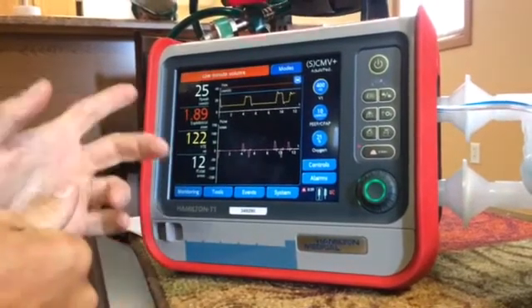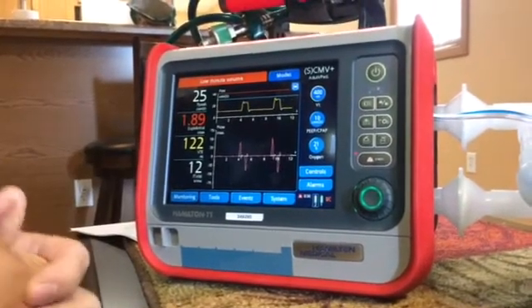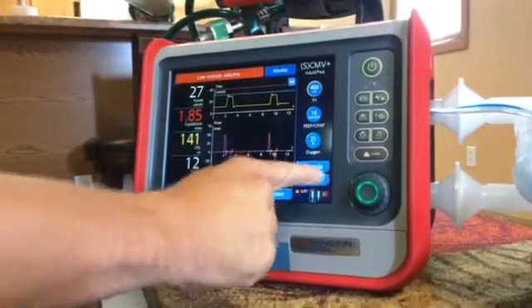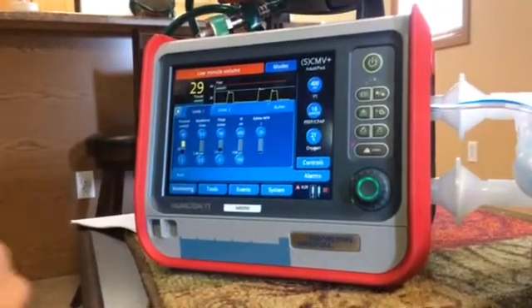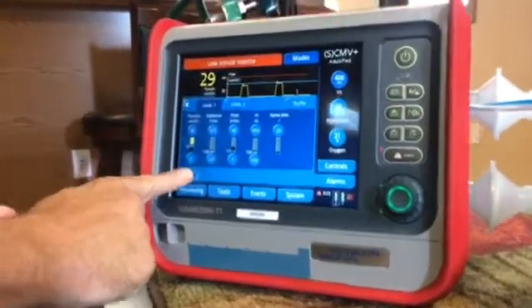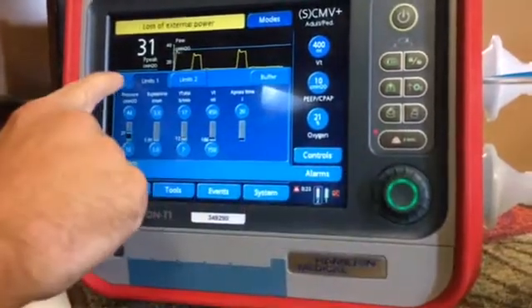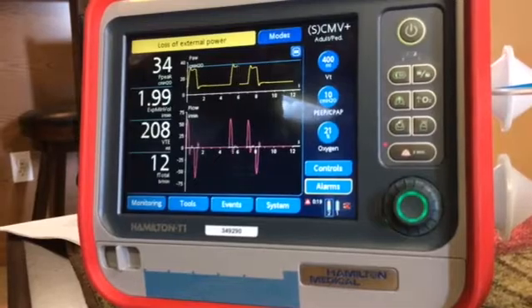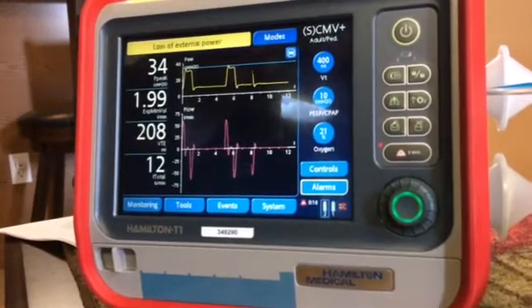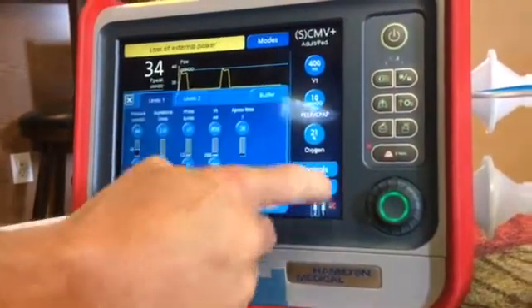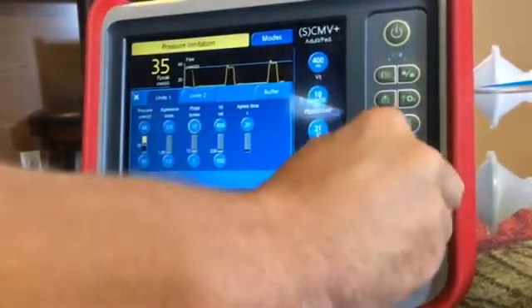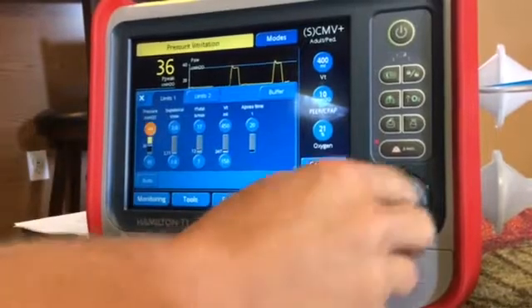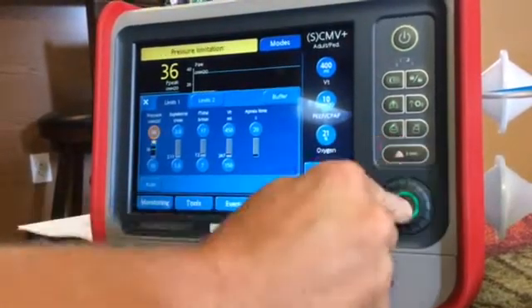Right now you notice we're getting a low minute volume alarm. What's cool about this ventilator is you can go into Alarms and hit Auto. When you hit that Auto function, it automatically sets your alarms for that patient — notice the low minute ventilation alarm went away. You can also manually set these alarms; if you wanted to set your high pressure limit to 60, push, turn, and confirm.